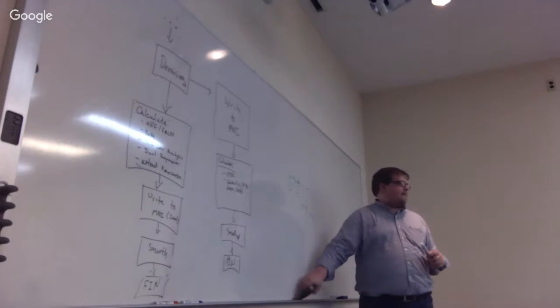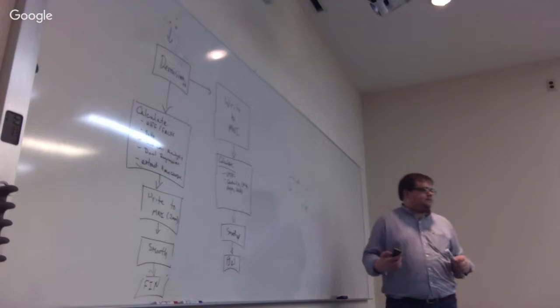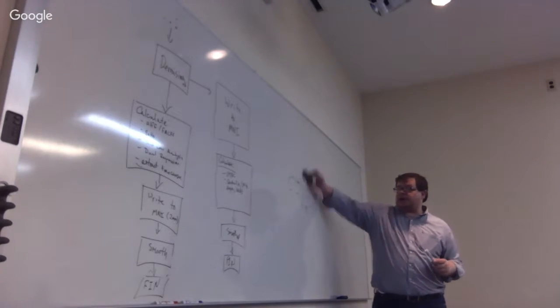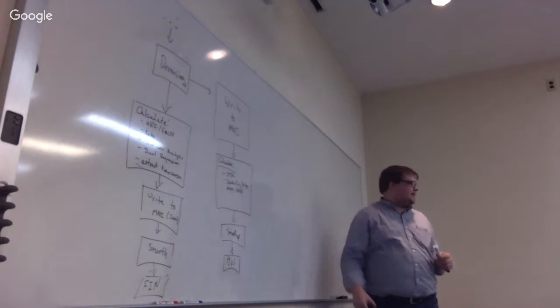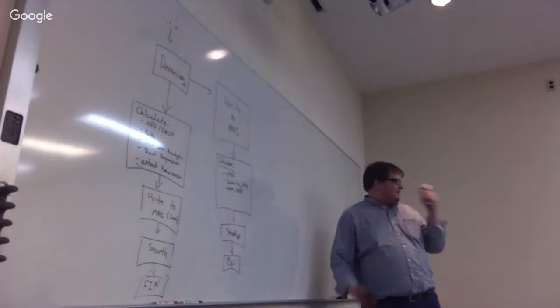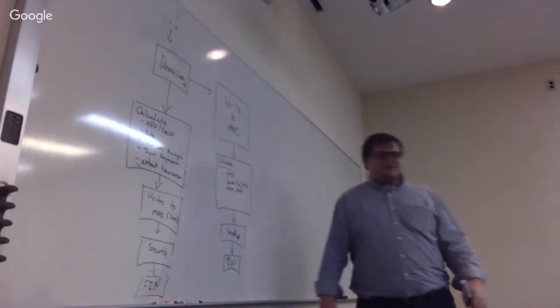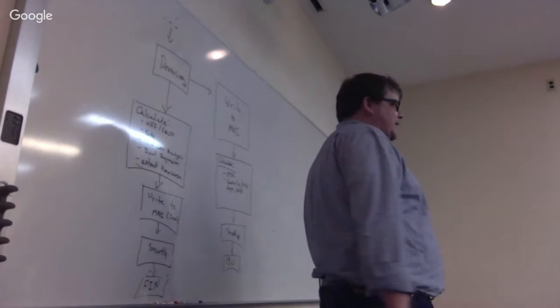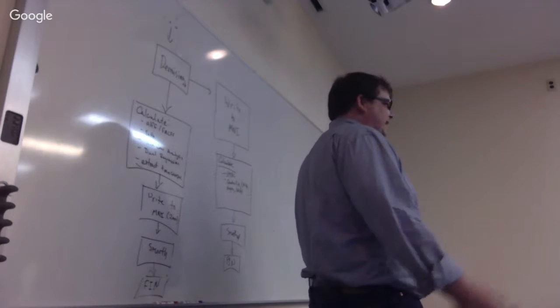In the case of SPM or FSL, whatever, we have to end up with larger blurs. Yeah. Well, originally SPM encouraged you to smooth to like 12 millimeters. Exactly, yes. You can just use like 8 millimeter voxels. And then your SNR goes up substantially, right? So yeah, why not?